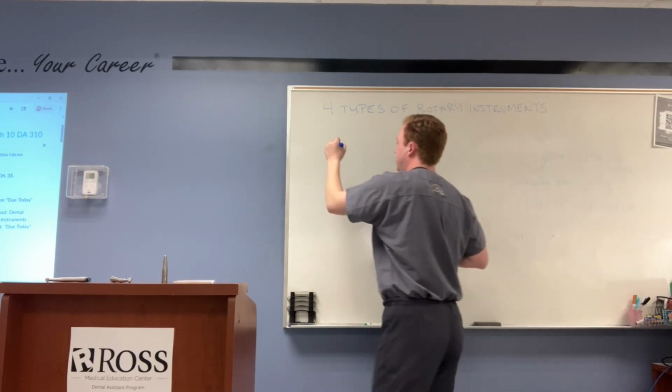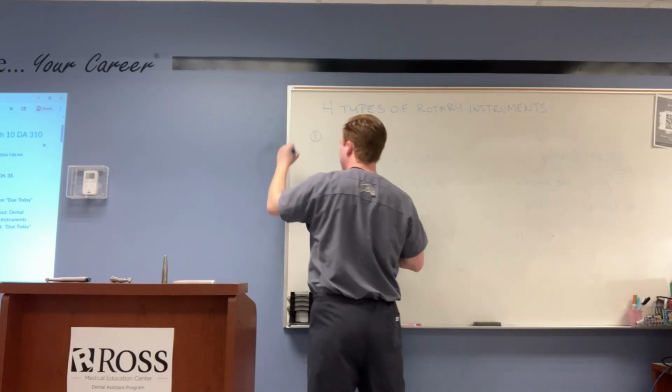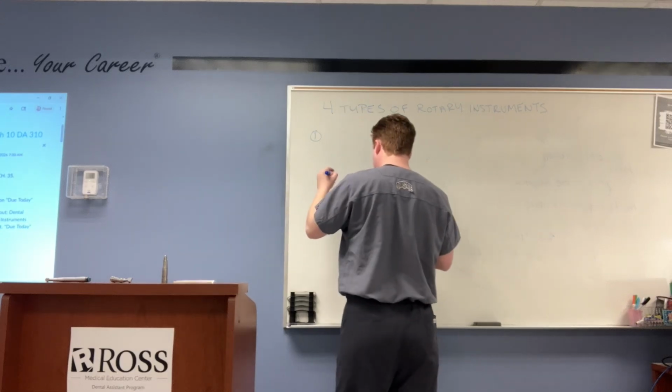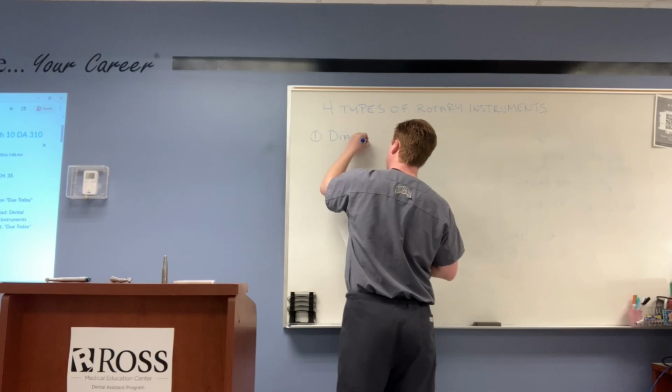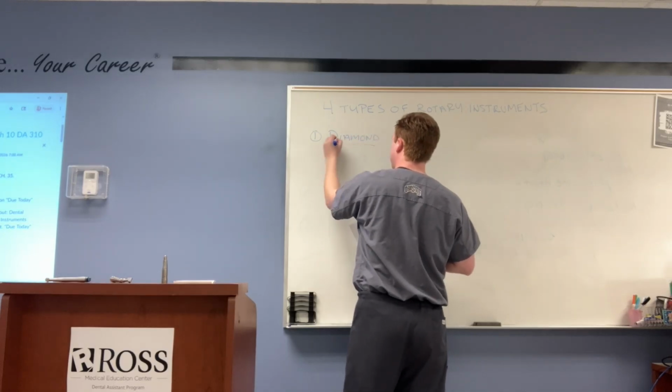Right, what was the first really expensive one I talked about? Diamond. So let's talk about them. The diamond burr. What is so special about the diamond burr?